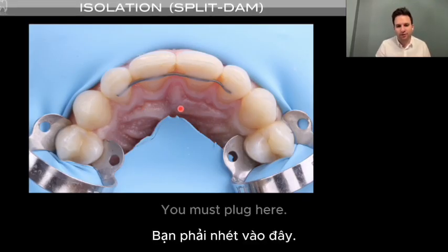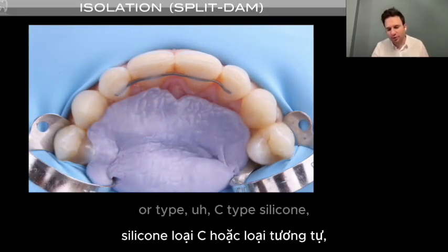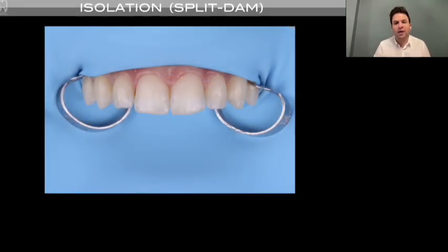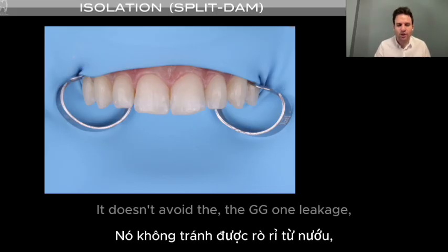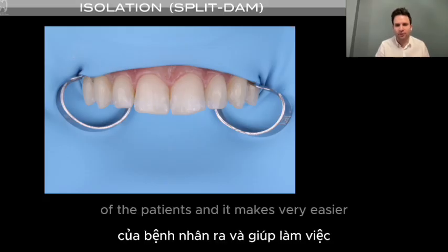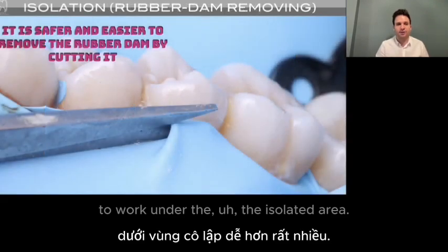You must close that gap by using A-type or C-type silicone, and then you can make your restoration. It doesn't avoid gingival leakage, but it directly retracts the lips of the patient, and it makes it much easier to work under the isolated area.